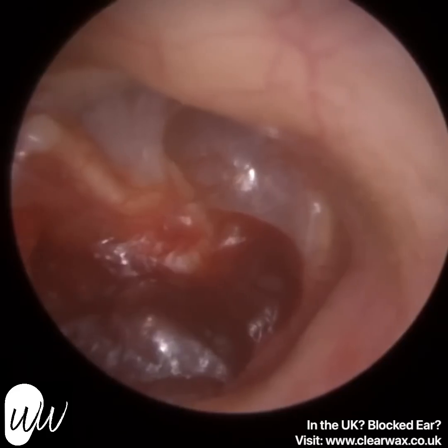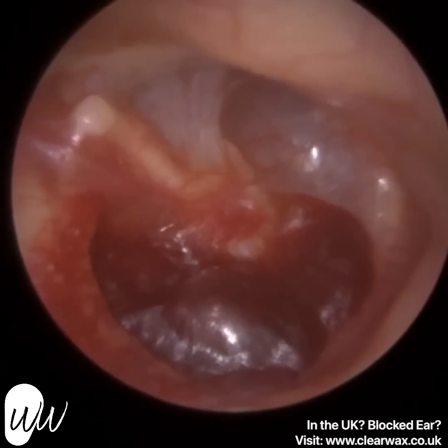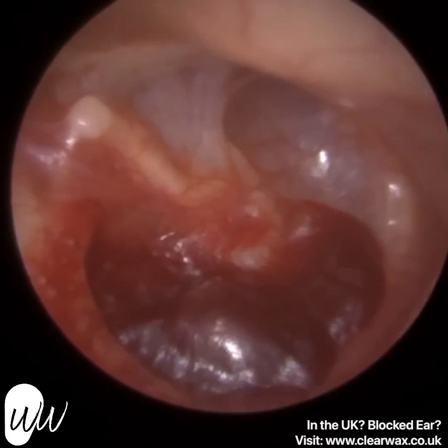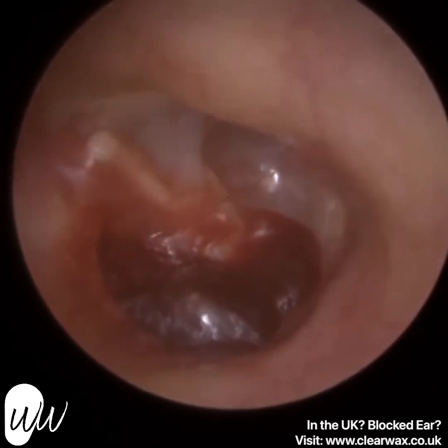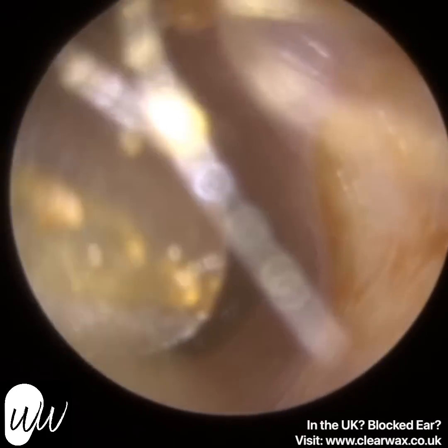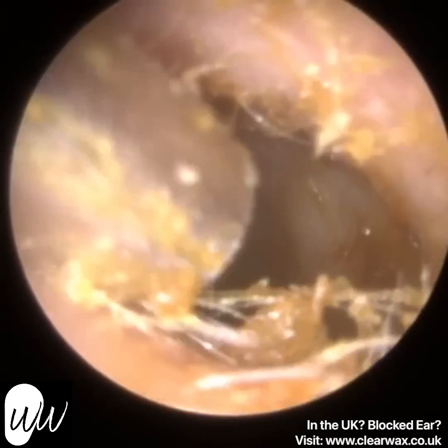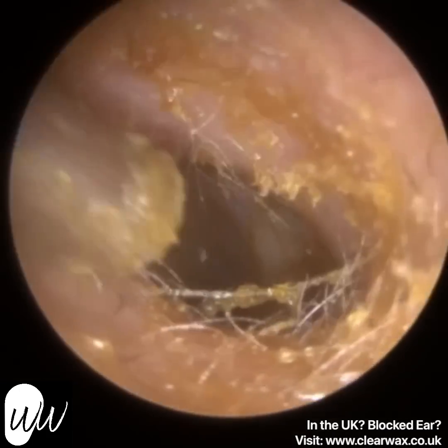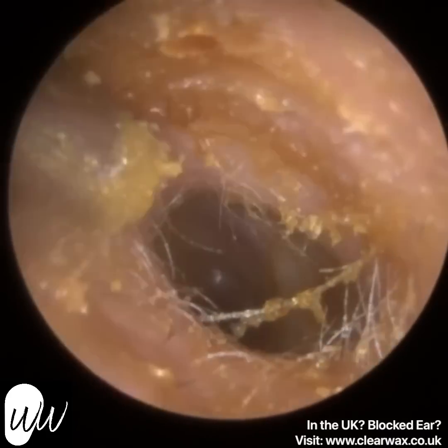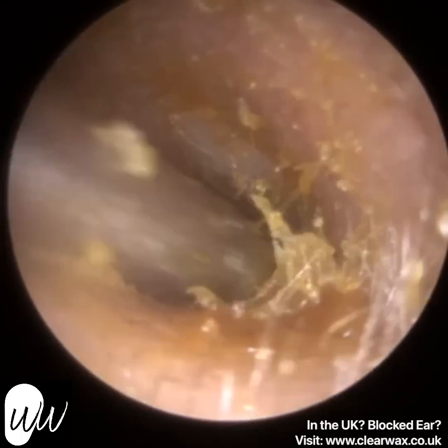So this is the right ear, and this is the acute otitis media. You can see the back part of the eardrum and the central part, the pars tensa, which is the main body of the eardrum, that's really acutely inflamed. There's hematoma there. It's very likely to be glue ear fluid behind the eardrum. So, and that was not visible, and the patient didn't come in reporting any symptoms with their right ear.